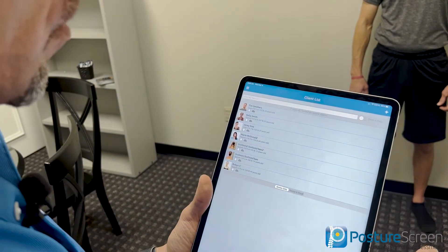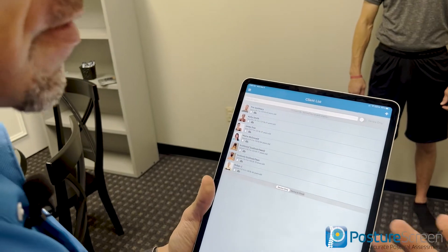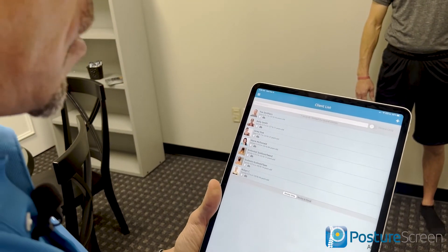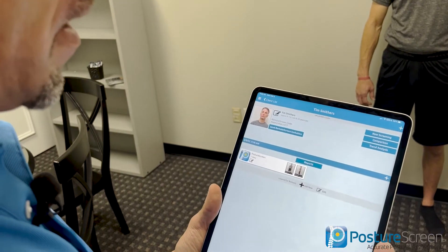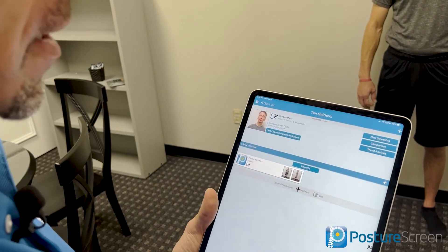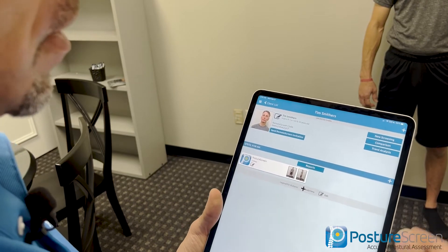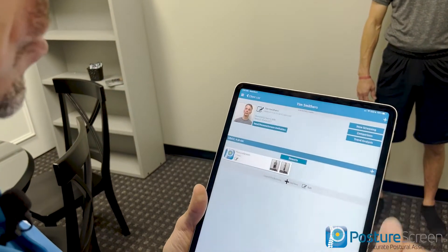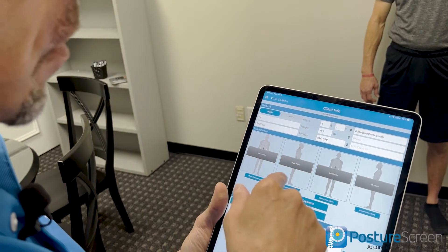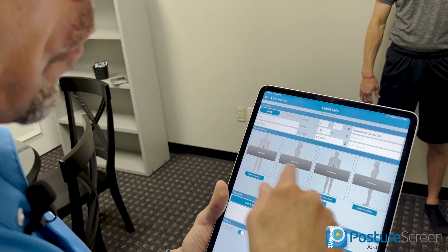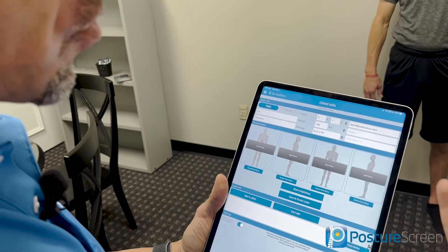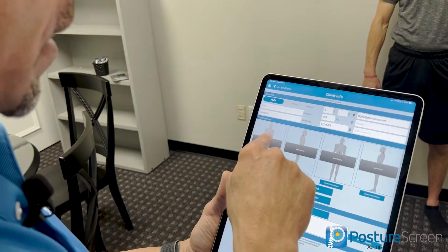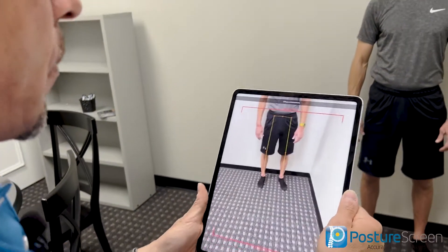If I go into the client list and choose someone already in there — you already know how to start an evaluation from scratch if you've been watching — I'm just going to select him and create a new evaluation. Then I click PostureScreen. If you do just two photos it's a two-view; if you do all four photos you get the choice of the clinical report and the patient-friendly report.